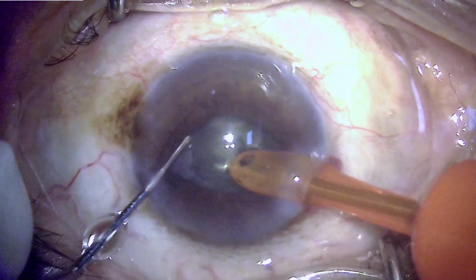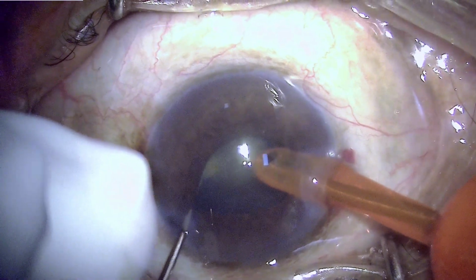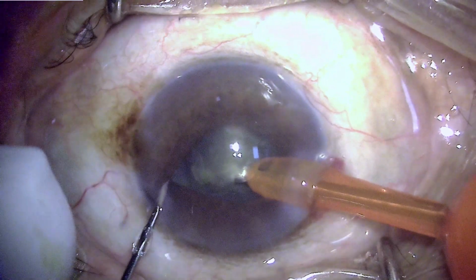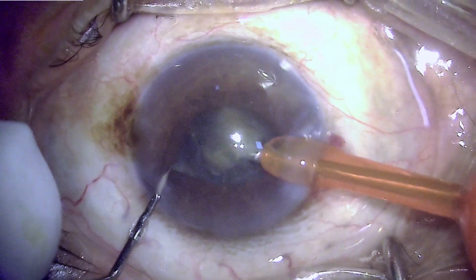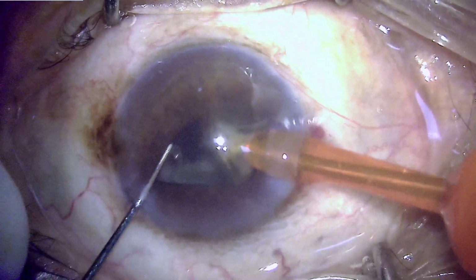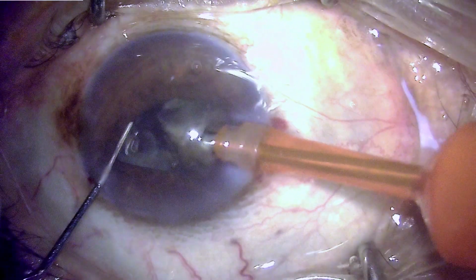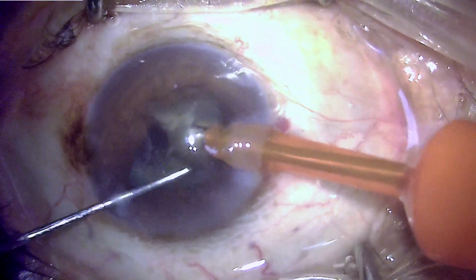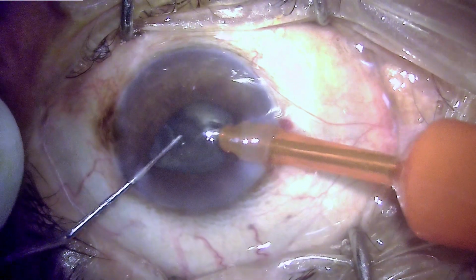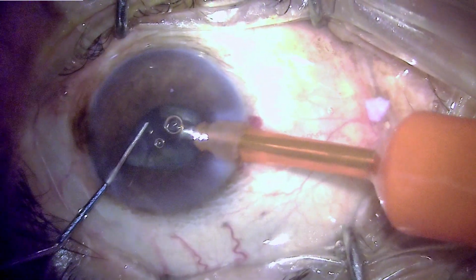and I am not complaining about it because it provides me with a good view, because that portion of the iris is pulled away, and it aids like an iris hook, keeping the iris away and providing me with some gap and some enlarged pupil so that I can have a view and we can proceed with emulsification. And in these situations, the iris which gets damaged because of being pulled into the port is not very great, and we have consistently seen this in our previous videos.